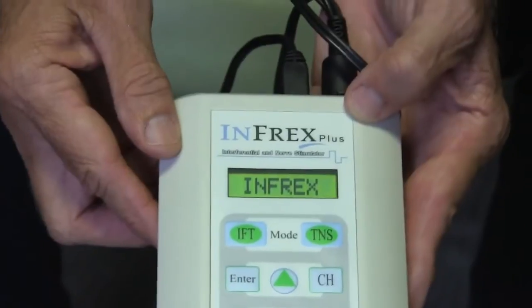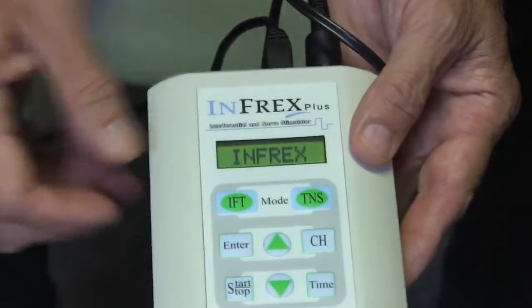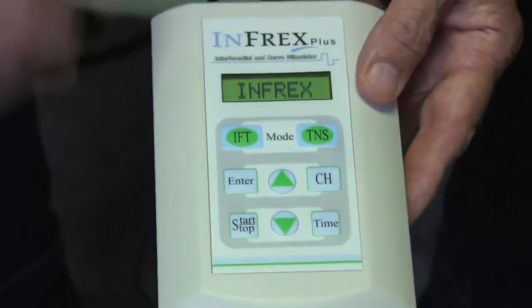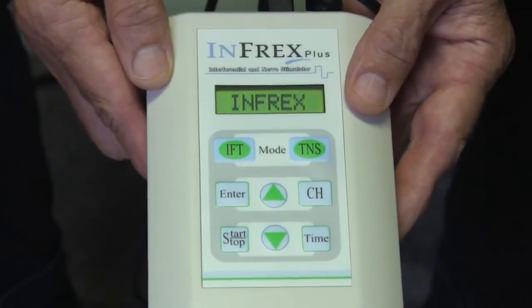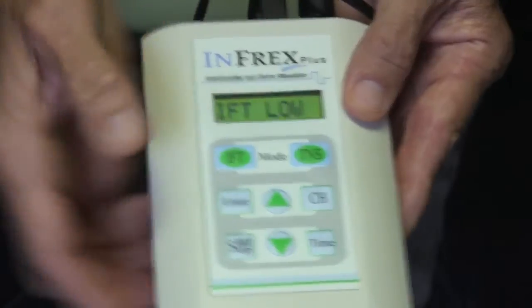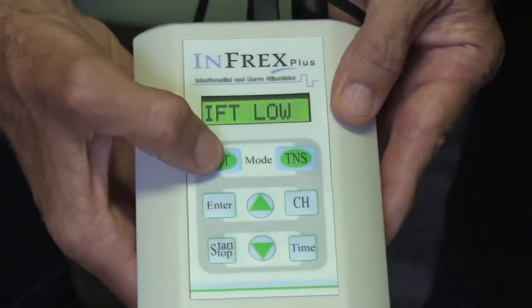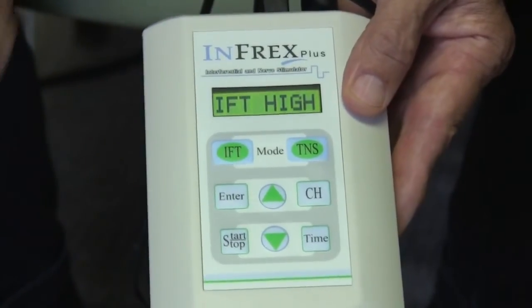Wait a second and you will see the word Infrex. The first thing you do is choose: do you want to do TENS or do you want to do IFT — Interferential? 99% of the time just push the Interferential button. It will come up asking IFT low or high. Push it again — we want to do high.